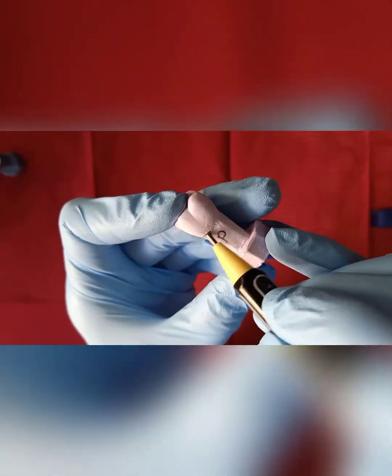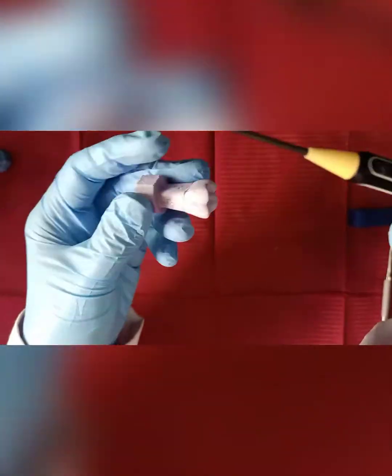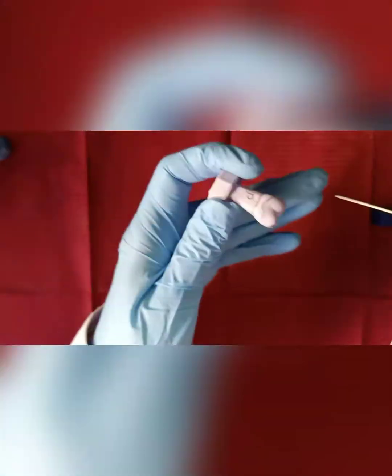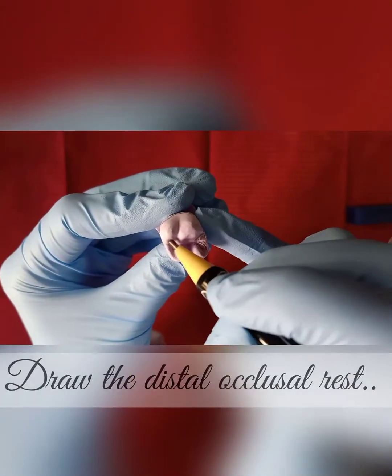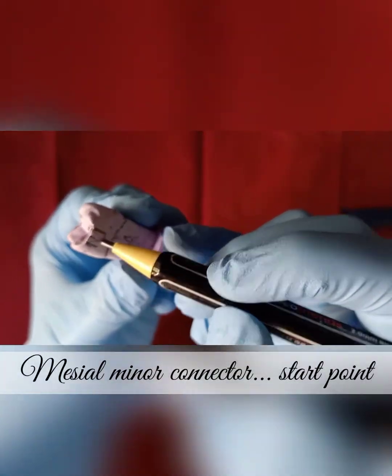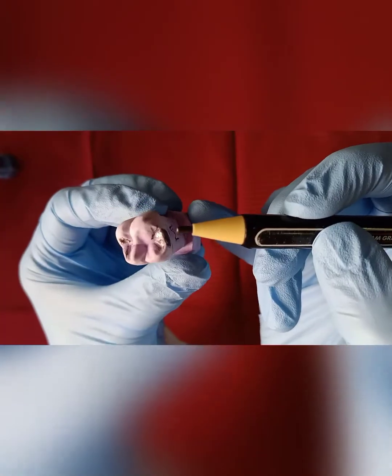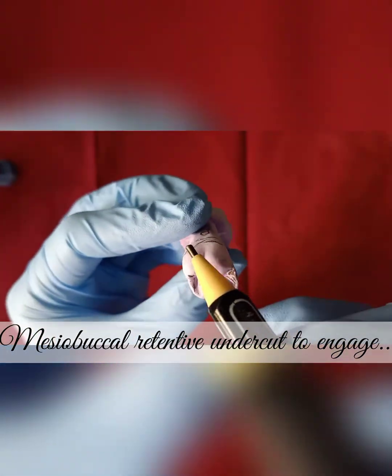For the ring on the upper, also define your surfaces, buccal, palatal, mesial and distal, then draw your cervical line. Draw your survey line, buccal and palatal survey line, and here start drawing the mesial and distal occlusal rest, and start with the mesial minor connector, which is our starting point as in the lower ring clasp, but here we have to engage the mesiobuccal undercut.